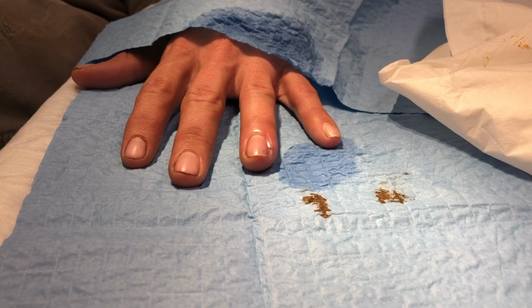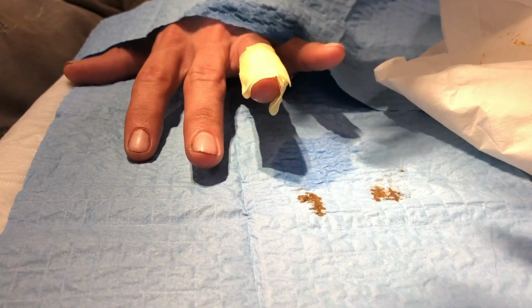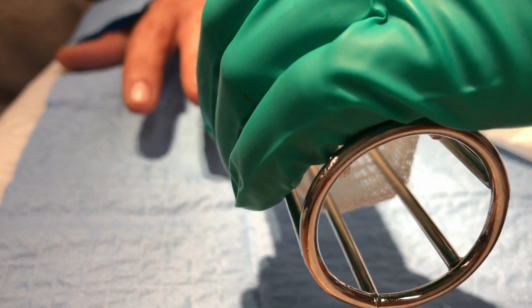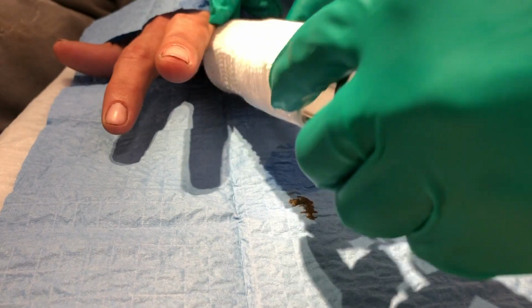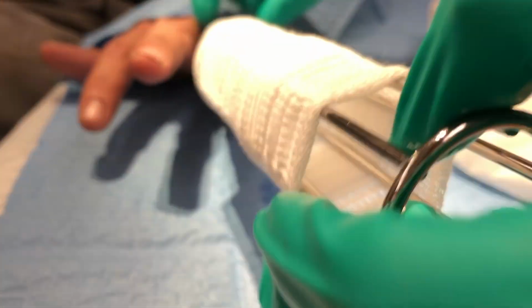The incision should be left open and a clean dressing should be applied. We chose to use a non-stick barrier followed by sterile tube gauze. This dressing can be removed at approximately 48 hours, and the patient should then resume warm soaks. Follow-up for a recheck is generally recommended either with a primary care physician or a hand surgeon.